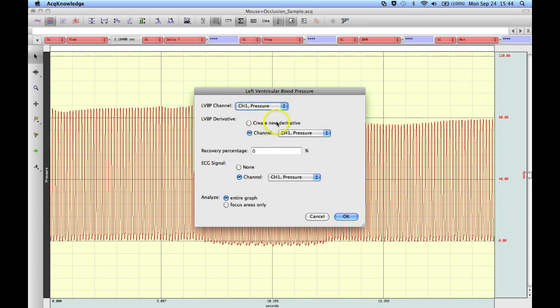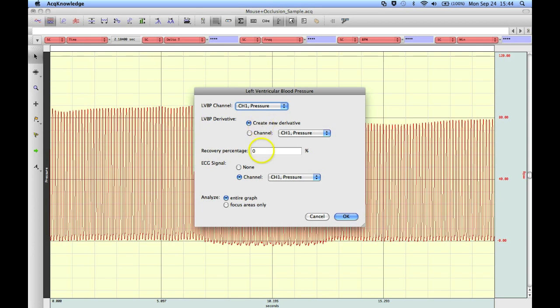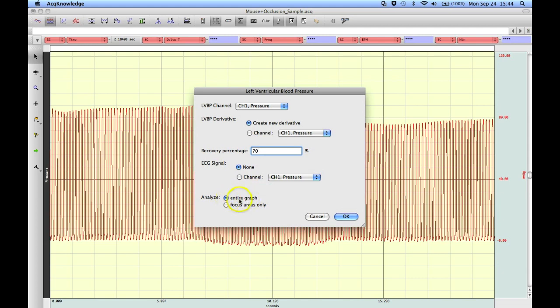We can create a new derivative of the left ventricular pressure channel, or you can use an existing one. This time I'm going to create a new derivative. I'm going to put in a recovery percentage of 70%. I don't have an ECG signal. If you do have an ECG waveform, the software will also perform an ECG analysis. And I'm going to run this over the entire graph. Hit OK.